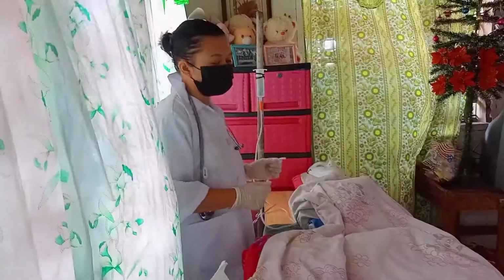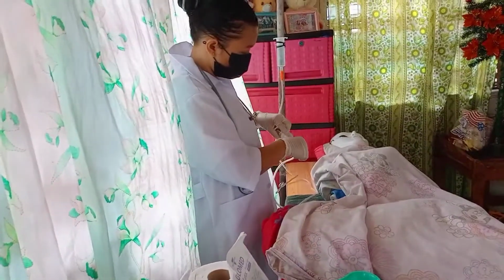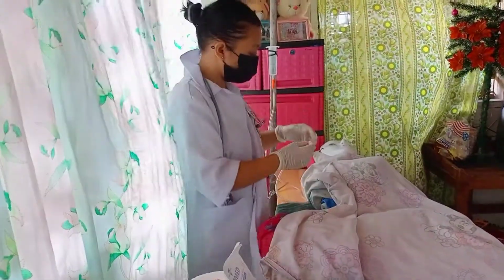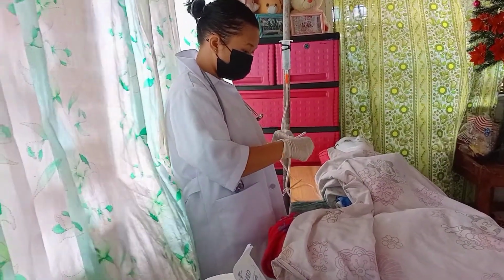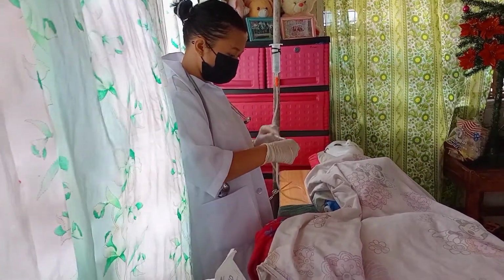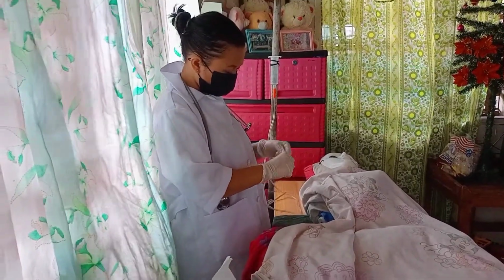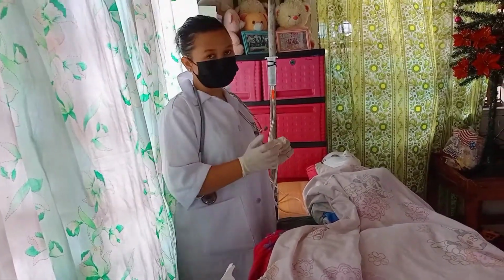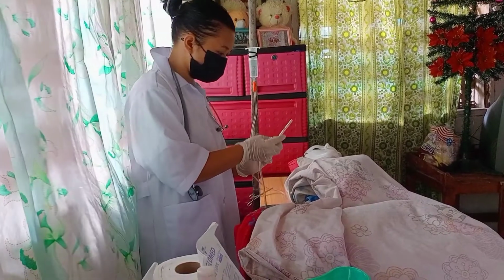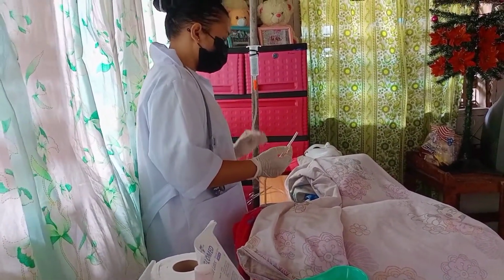Next is lubricate the tip of the rectal tube, about 5 cm, 2 inches of the rectal tube. Lubrication facilitates insertion and minimizes trauma. Next is expose the anal rectal area. Separate the buttocks to locate the rectum. Next is insert the tube smoothly and slowly into the rectum, directing toward the umbilicus.